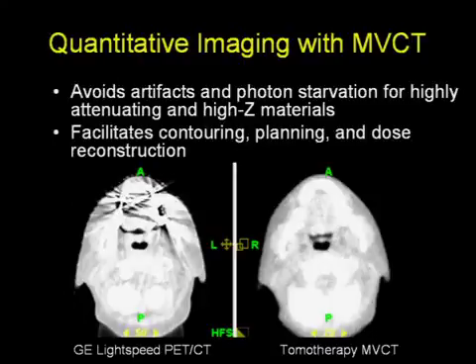And these are examples. I don't think they display very well here for some reason. But the images on MVCT, on cone beam CT, because the X-ray energy is high, most photons interact using Compton interaction, and therefore you lose the K-edge sensitivity, but at the same time you gain the density dependencies on the materials.